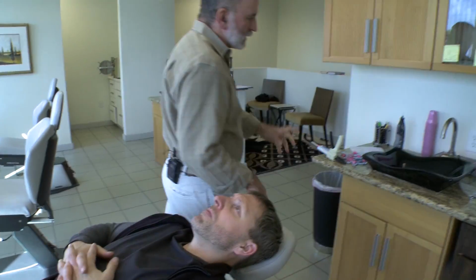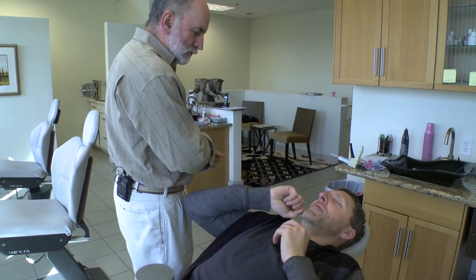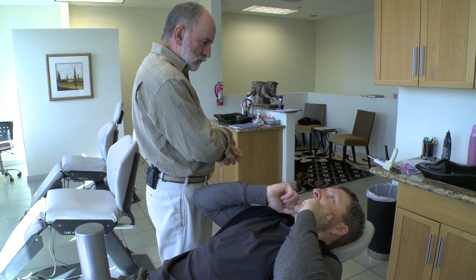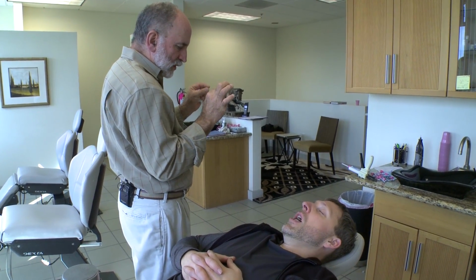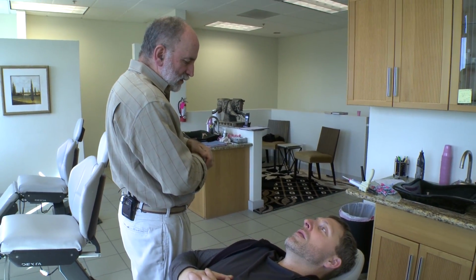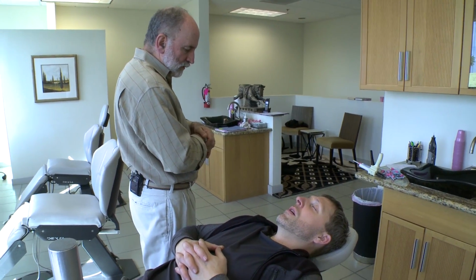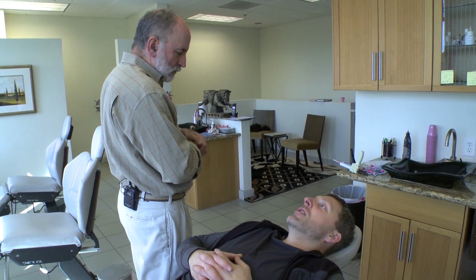Cool. Yeah, this is better. When I clench really hard, it's still flexing more up here than over here. Flexing more, meaning that when I squeeze hard, I feel almost everything right here, but not over here, which makes me wonder if the side's still lower. So when you lie down and first touch, they're pretty simultaneous. But as you clench, it's that first contact that's important. Is that your first contact with her? I think we're even. Yeah, cool.